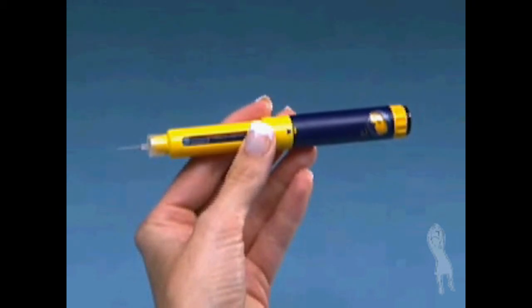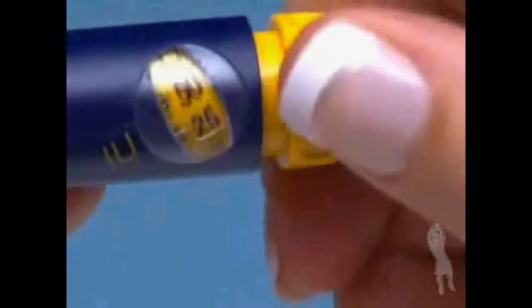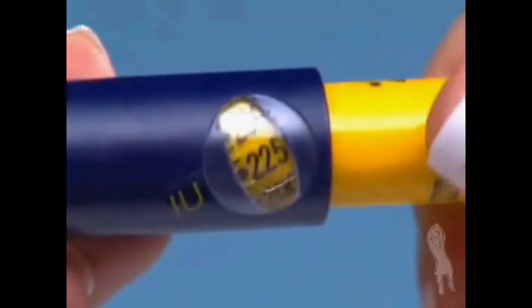For doses of 50 units up to 450 units, turn the dosage knob until the dot beside the correct number on the dosage scale is sitting in the middle of the dosage window.